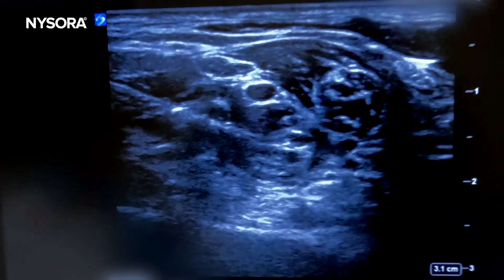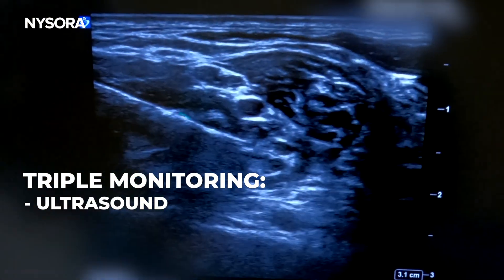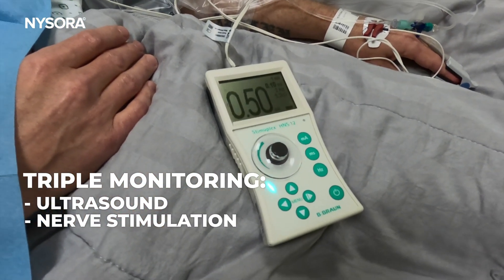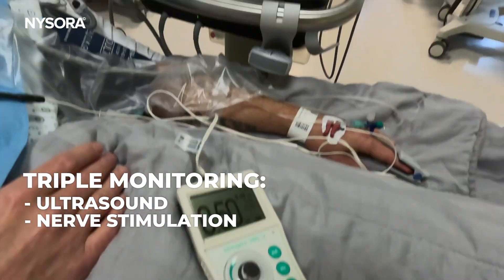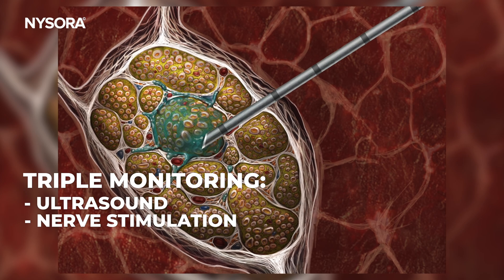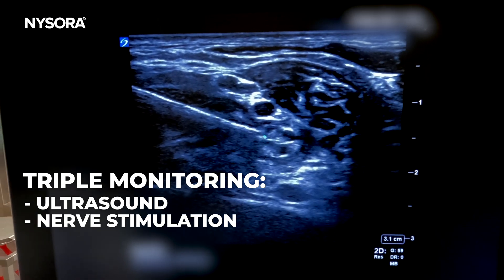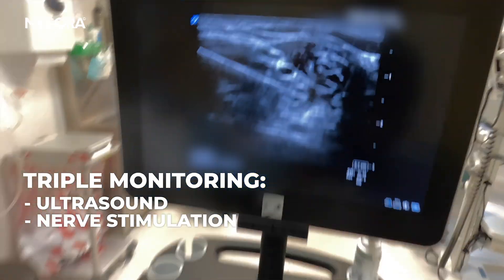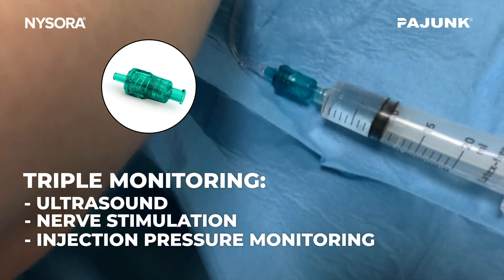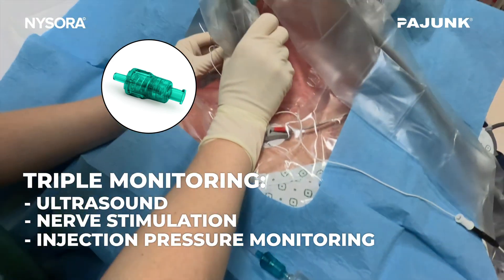It's a nice distribution. That was the interscalene brachial plexus block using triple monitoring: ultrasound for the needle-nerve relationship; nerve stimulation for electro-monitoring, where if the needle were to hit one of the elements of the brachial plexus, you would get an unexpected motor response alerting you to stop advancing the needle rather than injure the nerve; and the NerveGuard, an injection pressure device that shuts off the flow the moment the injection pressure exceeds 20 psi.